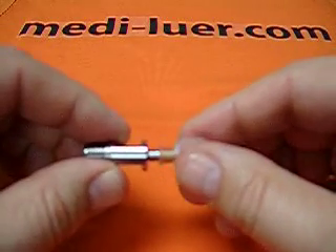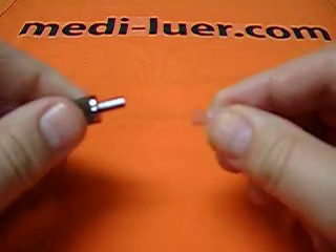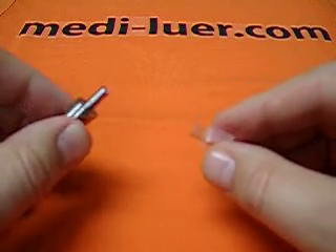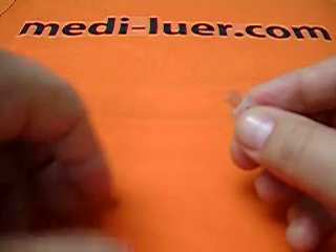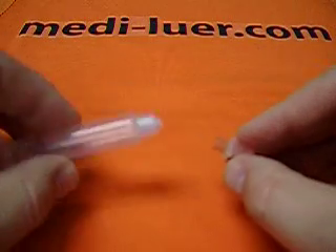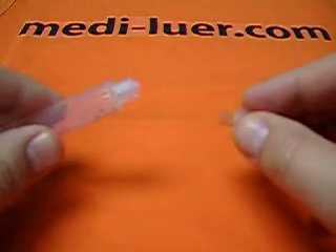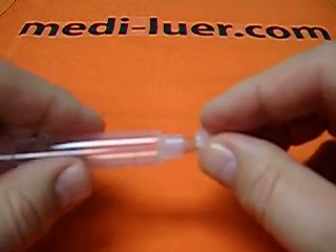We wonder why this is. The answer is quite simple and I will use an analogy. The people who wrote the standard did not know who was going to be putting the needle and the syringe together. They didn't know who was going to be working this. It could have been Betty Boop.